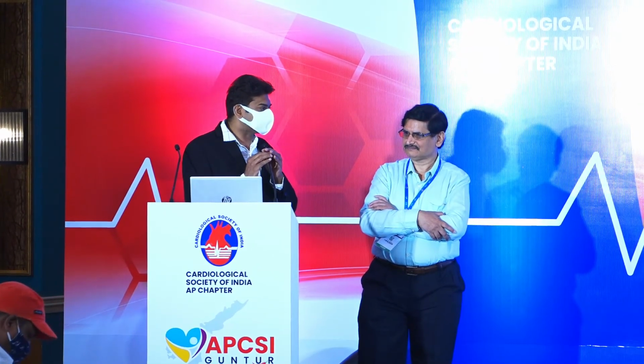Another thing is you should use a guideliner to deliver this OCT. And as Dr. Kaparadhi was saying, if it is a calcified angulated lesion and a very pinhole kind of situation, unless you dilate it properly, you cannot negotiate the OCT catheter in. Again, the guideliner would help in delivering the OCT catheter.